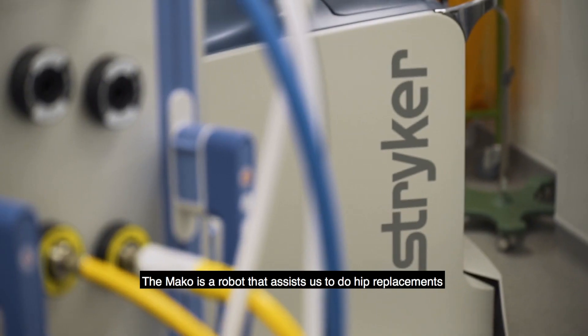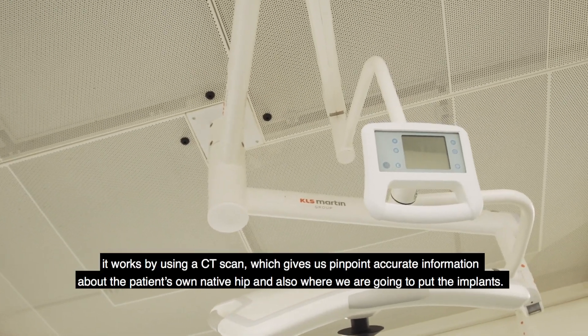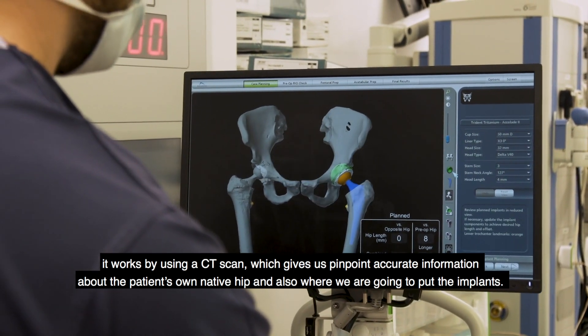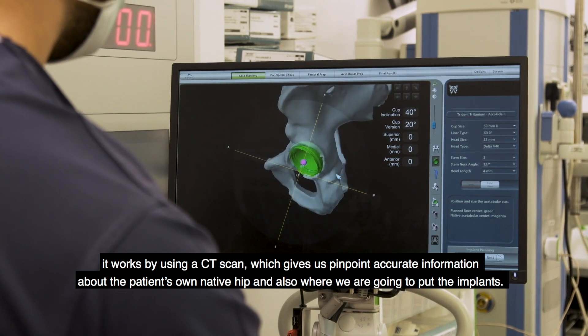The Mako is a robot that assists us to do hip replacements. It works by using a CT scan which gives us pinpoint accurate information about the patient's own native hip and also where we're going to put the implants.